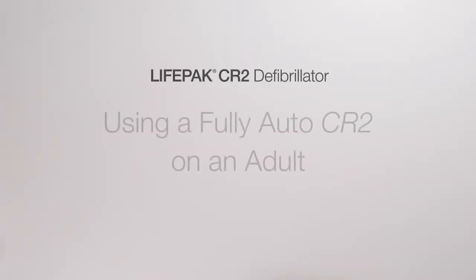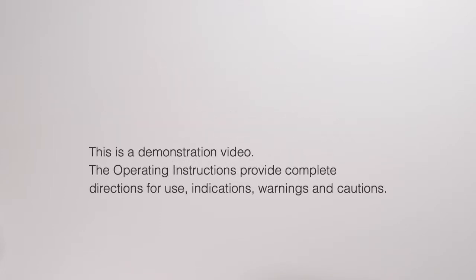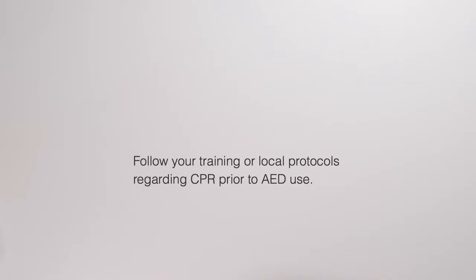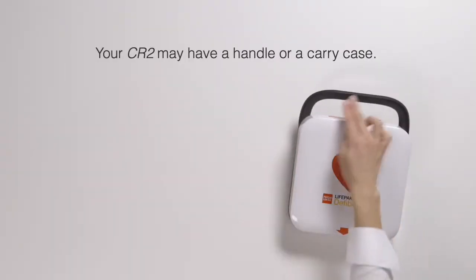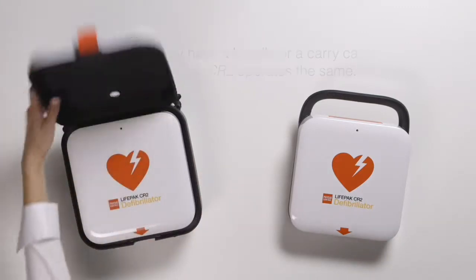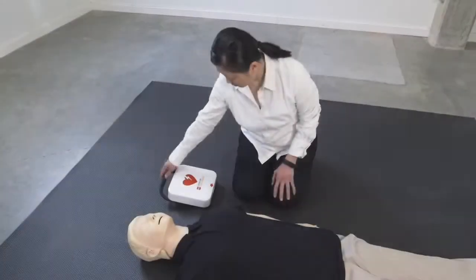This is an instructional video on how to use the fully automatic CR2 defibrillator from Physio Control and First Aid Accident and Emergency. In this demonstration we utilize compressions-only CPR. Please follow your recommended guidelines. Your CR2 defibrillator may come with a handle or a carry case. Once you have recognized your patient is unresponsive and not breathing, place the device next to the patient and open the lid.